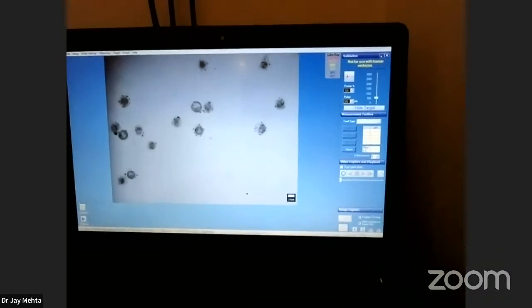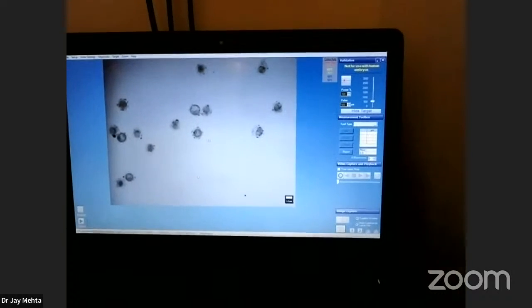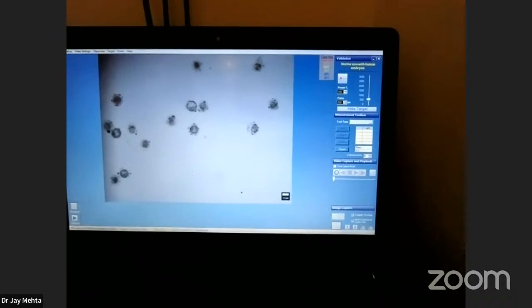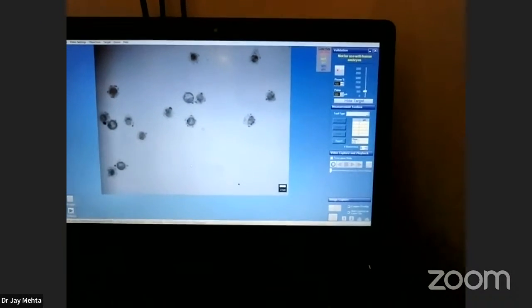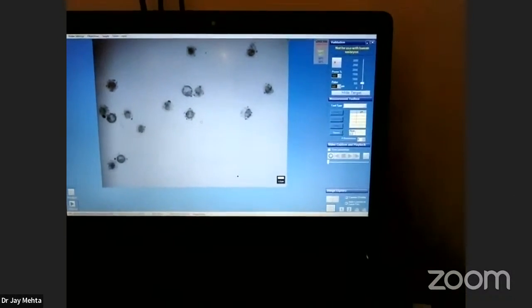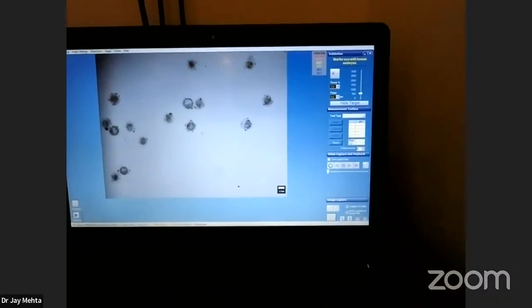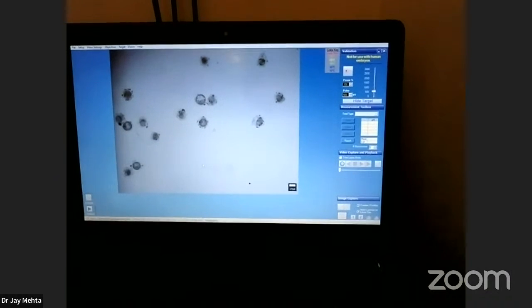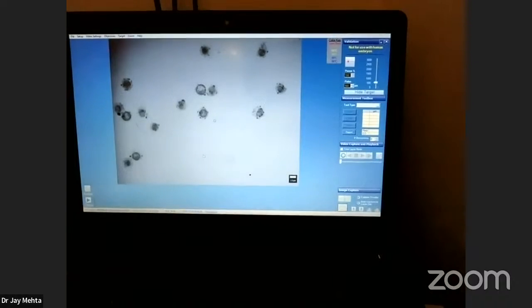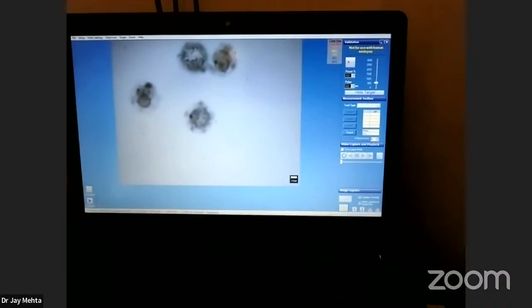This is not the magnification on which, as a clinician, you should be able to choose. As a clinician, we may be very good embryologist and we may be very good clinician simultaneously. But this is a lecture which is meant predominantly for those who have a busy IVF practice and don't get enough time, due to their work routines, to enter the IVF laboratory very frequently. So what people normally do is rely on their biologist or their embryologist to tell them if it is a good grade embryo or if it is a bad grade embryo.